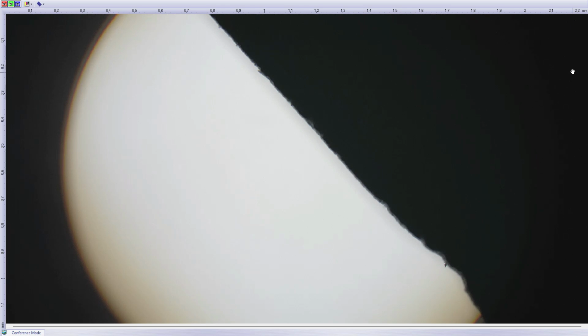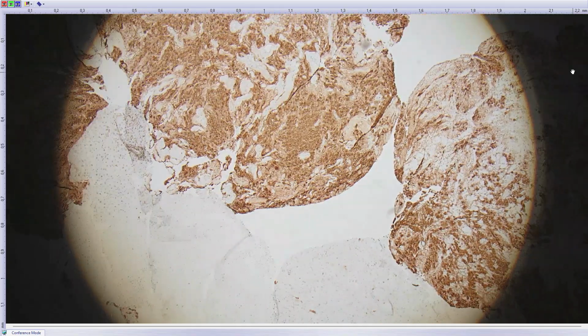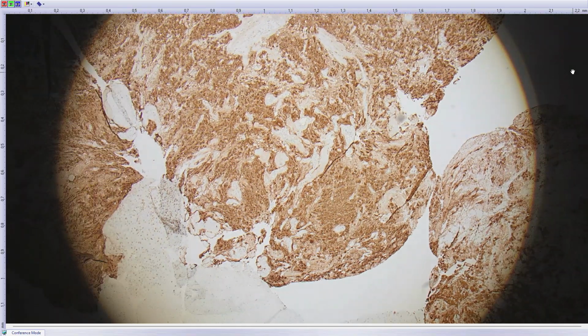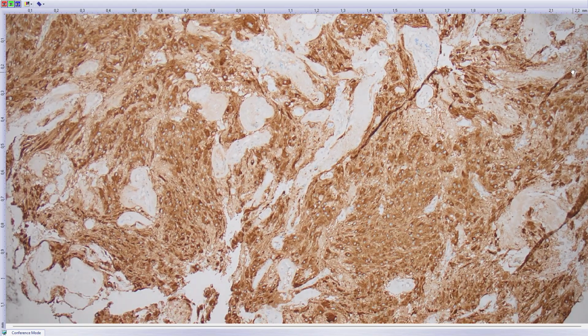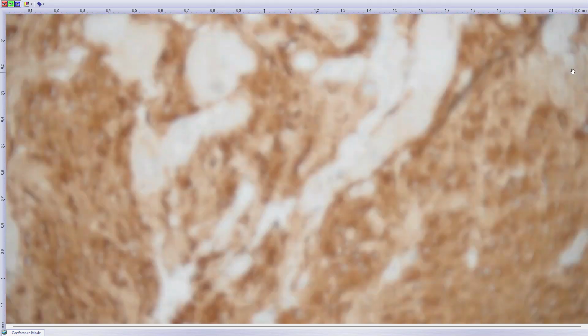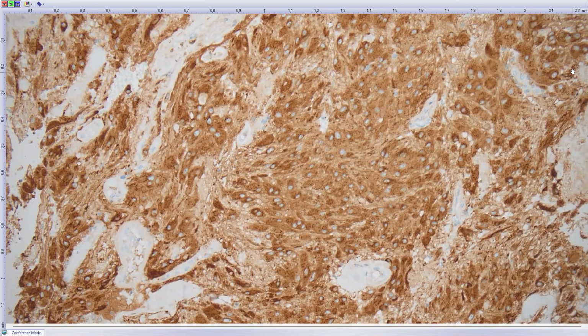And this is another quite important immunostaining. This is quite a new antibody, at least in our lab, and it's called GPNMB, glycoprotein non-metastatic melanoma B protein, which is positive in subependymal giant cell astrocytoma.